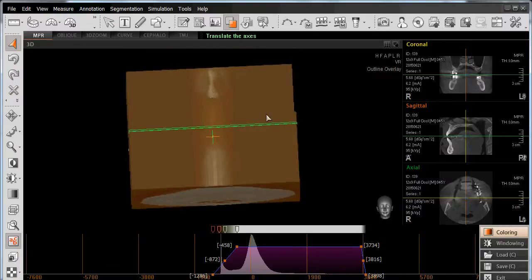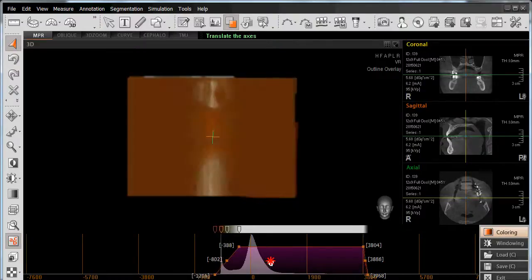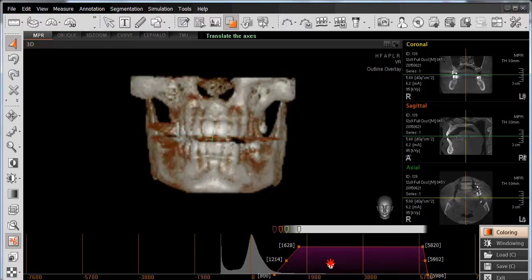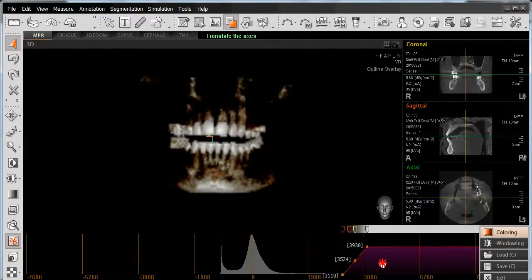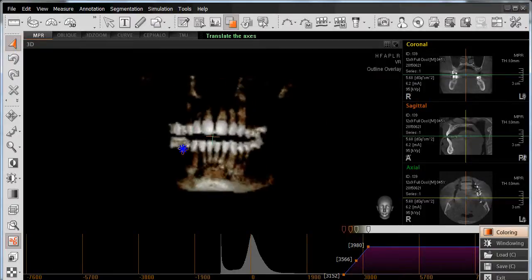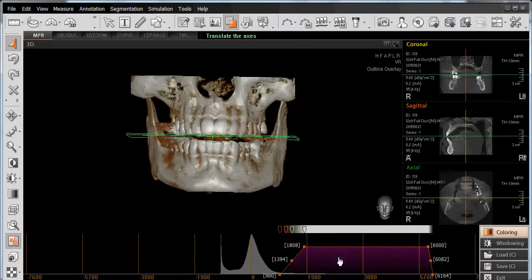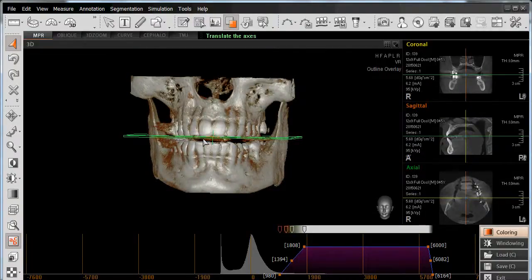I'm going to use these segmentation tools to segment out based on density. By left-clicking and sliding to the right, I've now filtered out my air again. Continuing to the right, I'm filtering out my soft tissue and separating out my hard tissue. Cortical bone typically starts right around 1200 to 1300 or so. As I left-click and continue to the right, this value gets higher and I begin segmenting out any density below this number, roughly 3100. Slide left or right until you have your desired density range established.